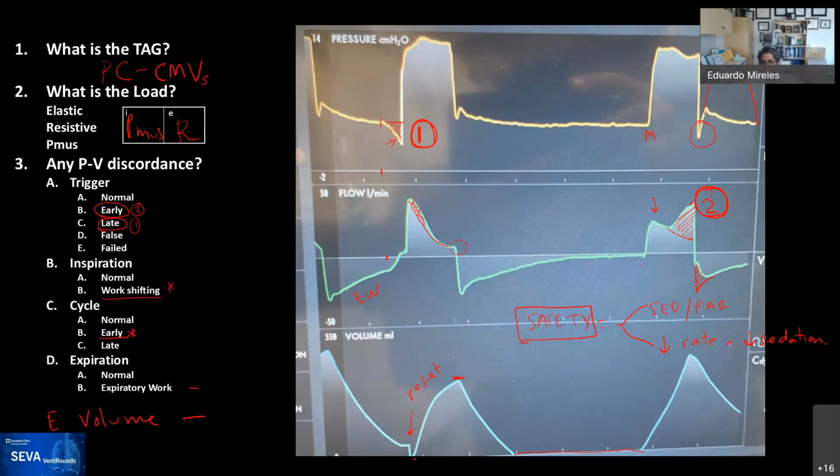One of the ways we have dealt with it is by decreasing the rate and letting the patient take its own rhythm. The other is by decreasing the sedation and just biting the bullet and letting the patient get untoxic after several hours. They come back and the medulla starts triggering on its own. But to be fair, there's no good evidence, at least to my knowledge at this point, to deal with that.